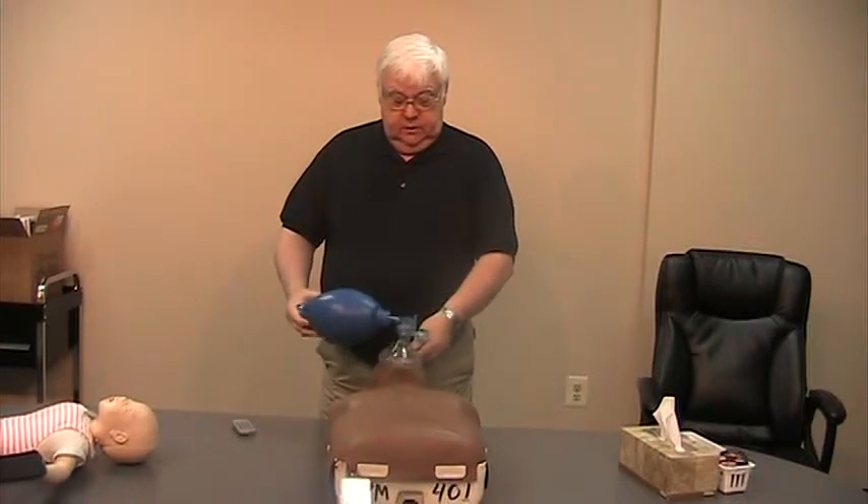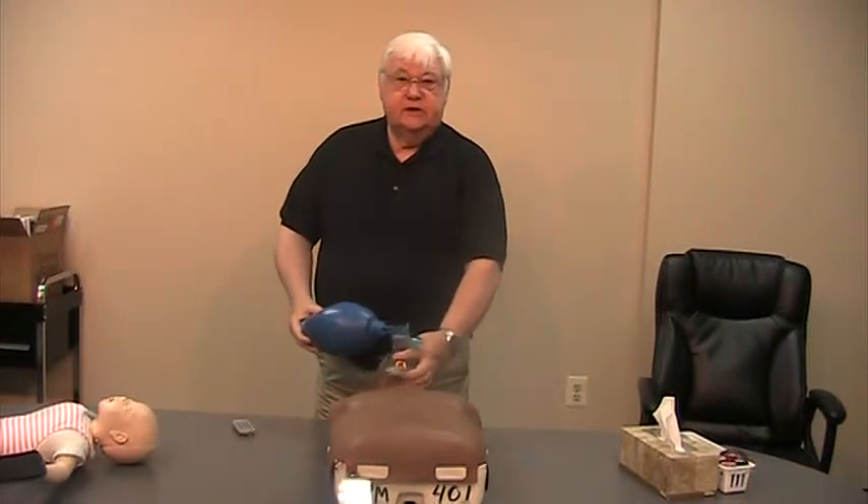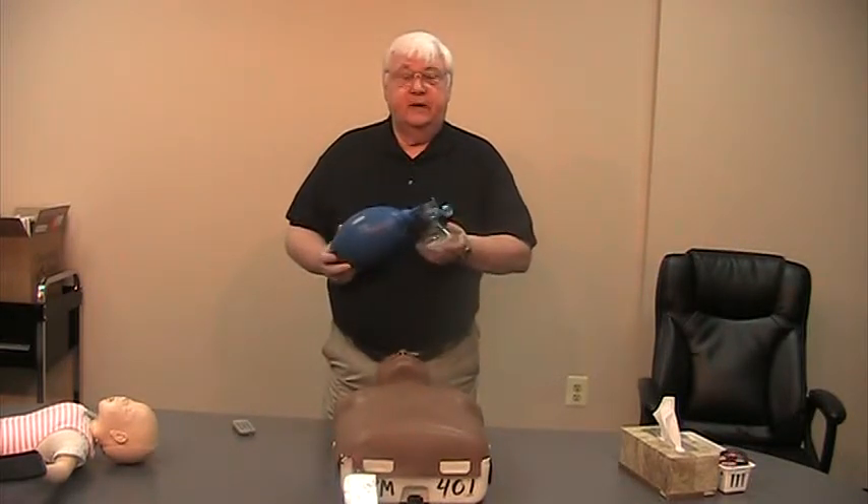So that's the position: pointy side over top the nose, good seal on the face, EC position, head back all the way, two slow squeezes of the bag.